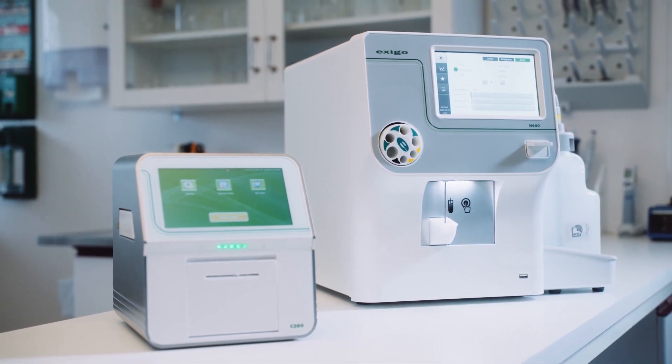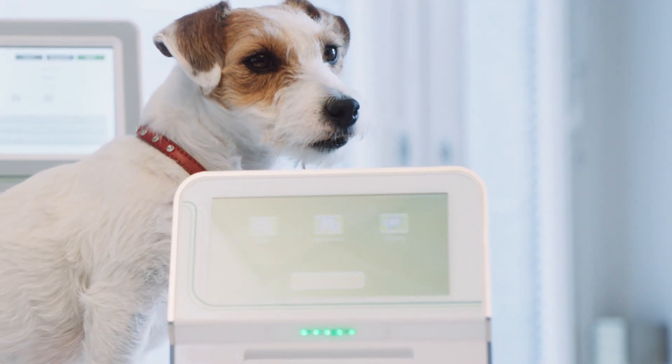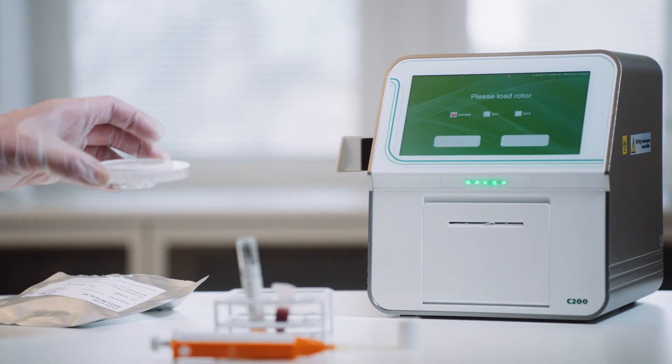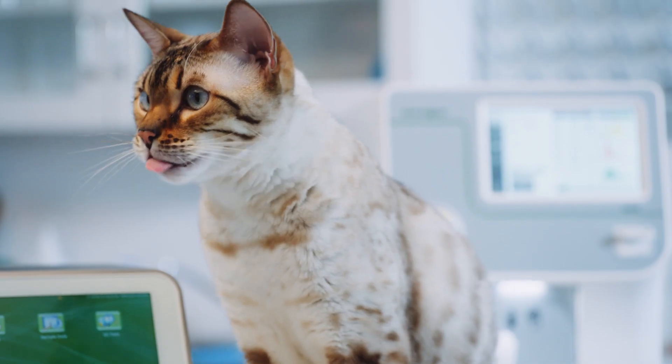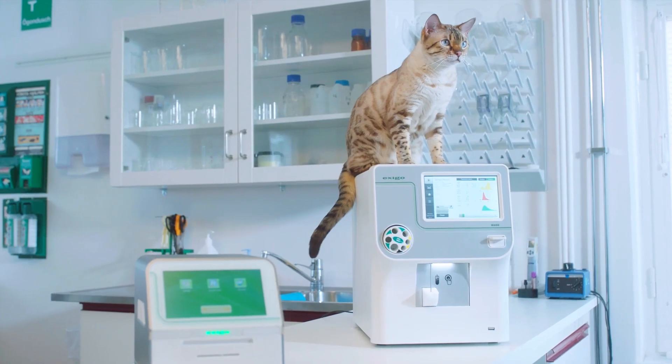Together, the Exigo H400 and the Exigo C200 are a perfect match for a laboratory, providing the parameters clinics require for hematology and clinical chemistry for small, exotic, and larger animals.